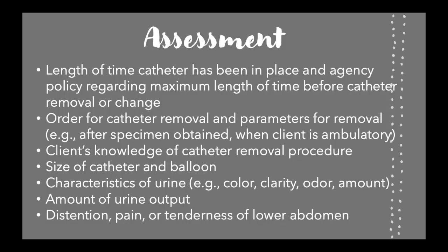Removing an indwelling catheter. Assessment should focus on the following. Assessment helps in determining the patient's need for a certain intervention or procedure. It also provides information about the patient's current status. This procedure is ordered by the physician to terminate urinary catheterization and permit return of client-controlled voiding.